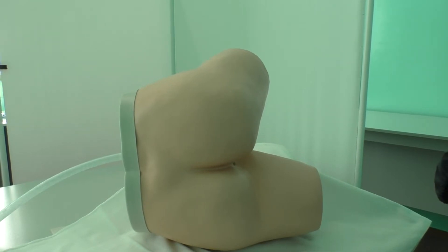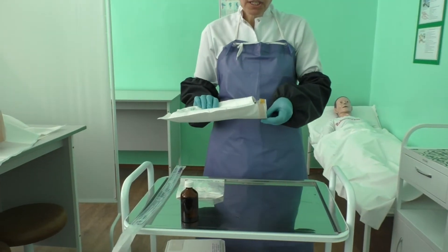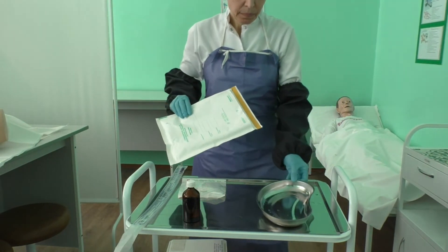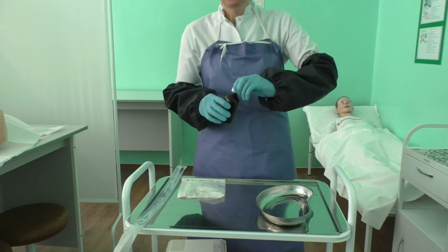Remove the blanket. Help your patient to undress if necessary. Gently assist the patient to lie on the left side with knees well flexed. Place an oil-coated napkin on the bed sheet, then place a cotton napkin. Open the bag with a sterile kidney dish and place it on the procedure trolley.